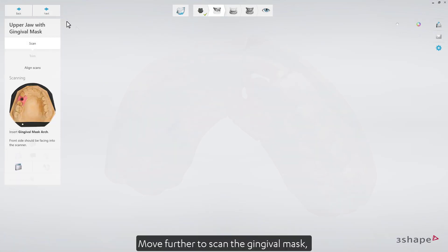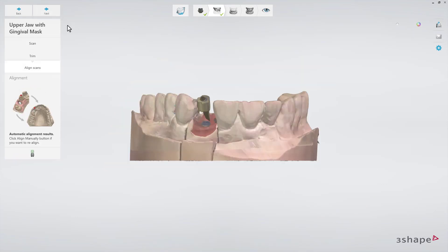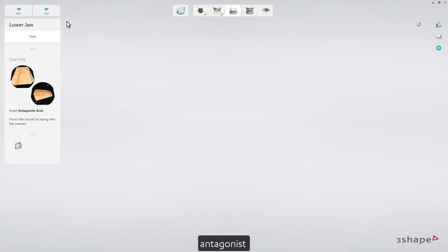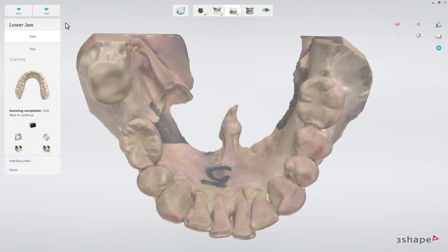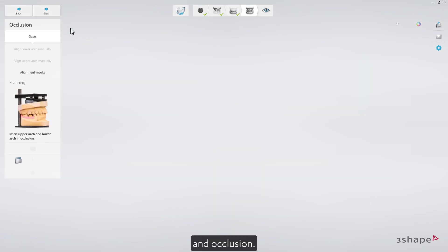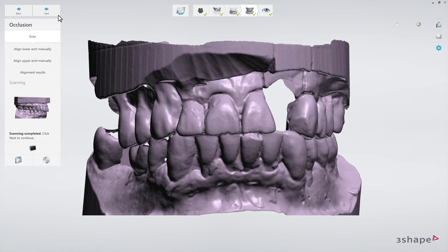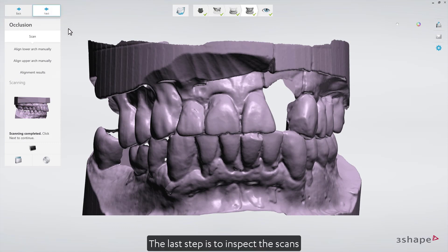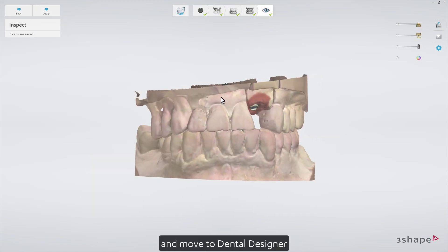Move further to scan the gingival mask, antagonist, and occlusion. The last step is to inspect the scans and move to dental designer.